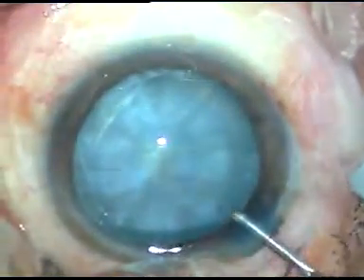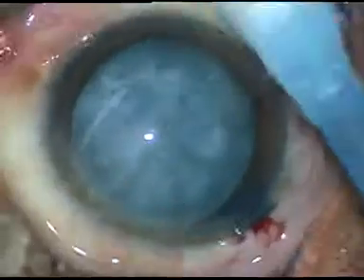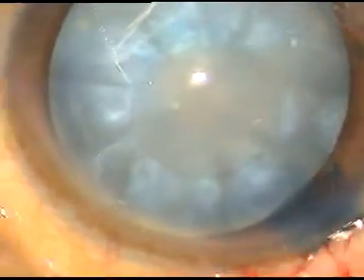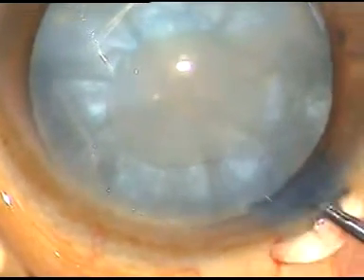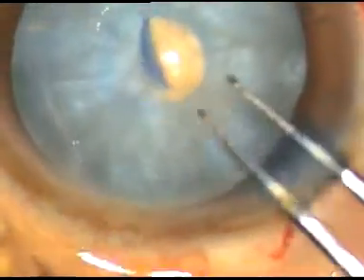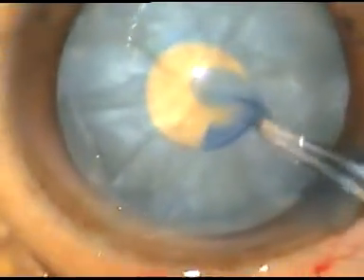I am trying to flatten the central portion of the capsule. This is another side port. And now, this is my rhexis. As I make a puncture at the center, a lot of oily fluid has come out. Express out this fluid. Hold this capsular tag with utrata, and make a very small rhexis.